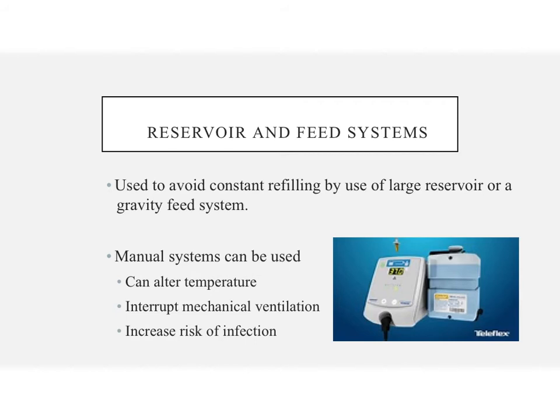Now, with a gravity-fed system, there is a small inlet added to a reservoir. The picture on this slide would be an automatic or gravity-fed system. They have an inlet, and there's a video of this specific humidifier. It's the Neptune, and it's a wick humidifier, so water goes through a column inside the humidifier itself. There's an inlet here and one here, and it goes through the humidifier.